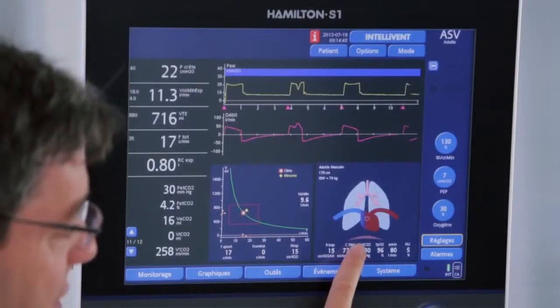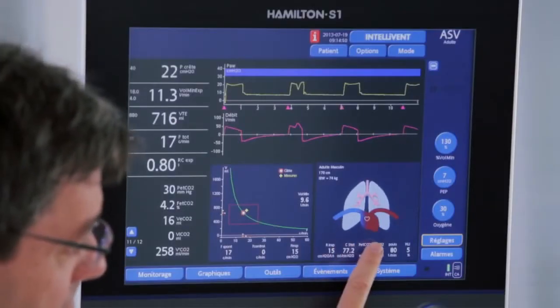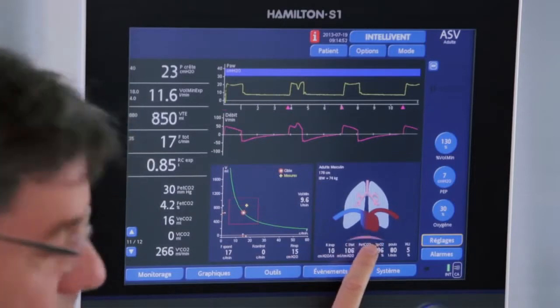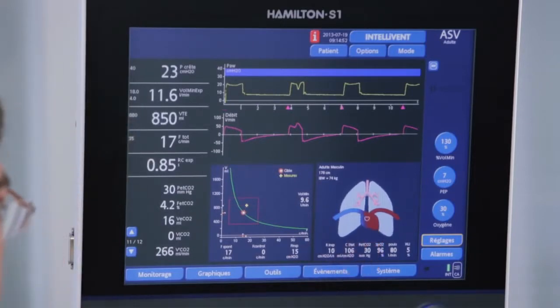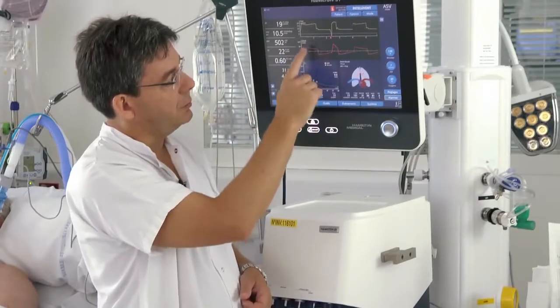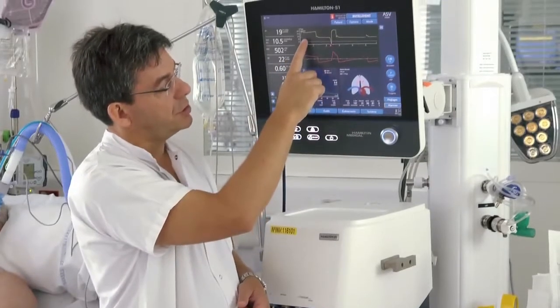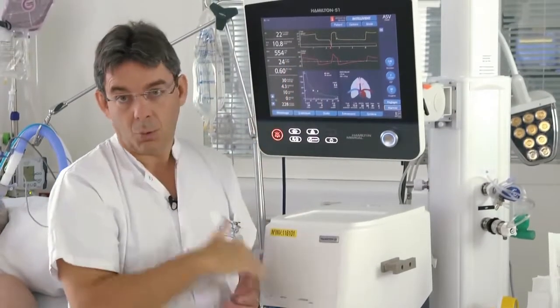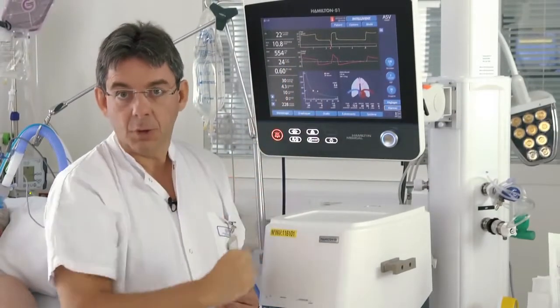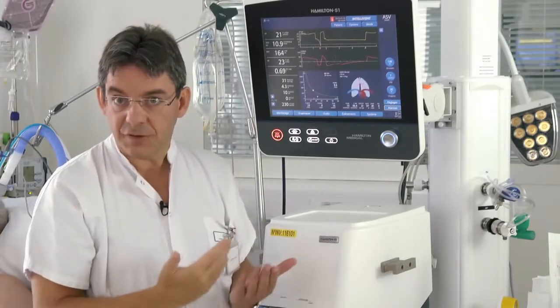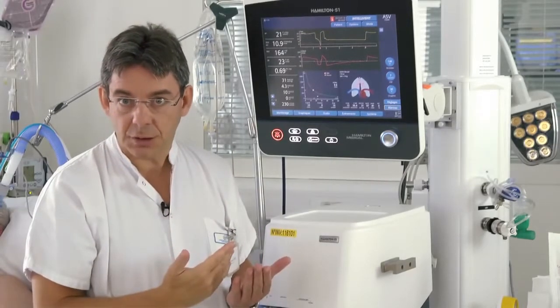We can see the diaphragm activity, indicating that the patient is actually active. At the top of the screen we see the pressure and flow waveforms, which are also very useful to assess patient-ventilator synchrony.